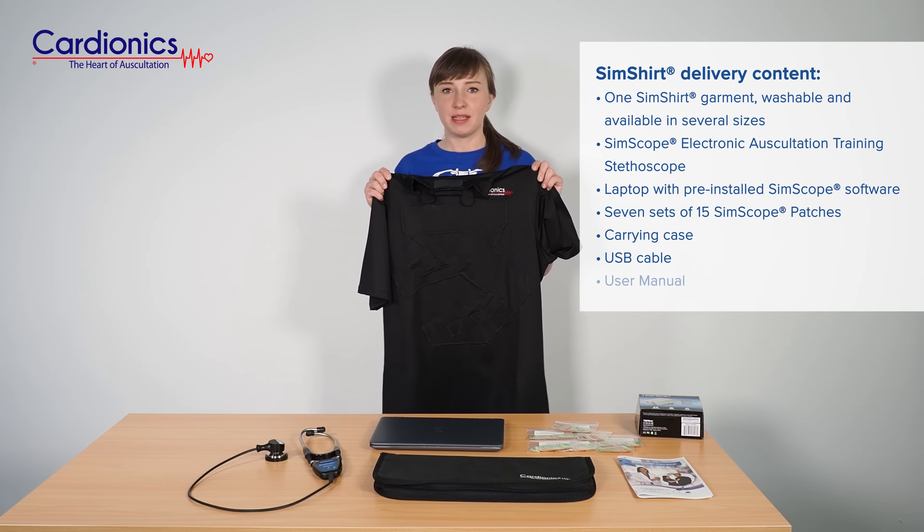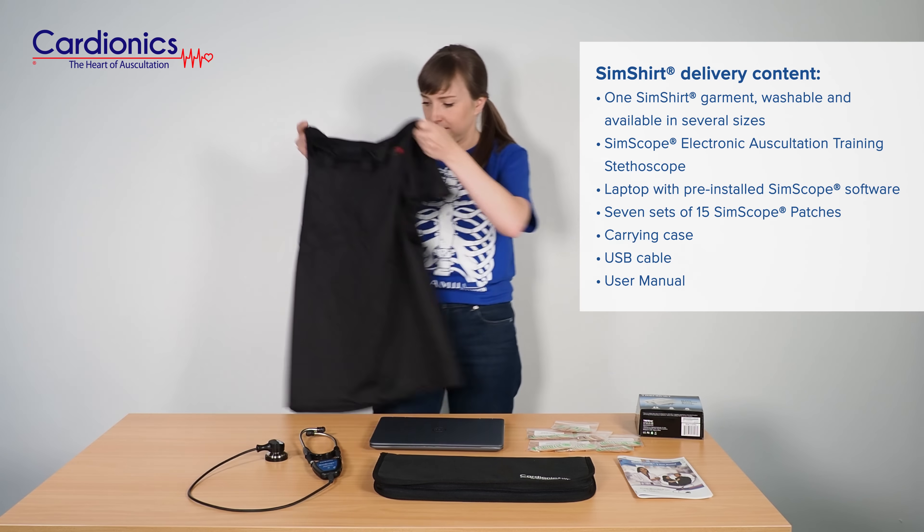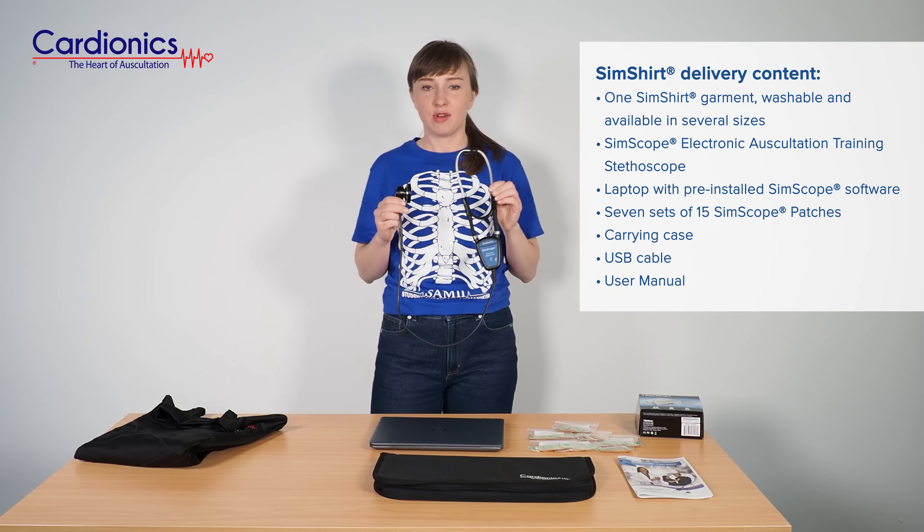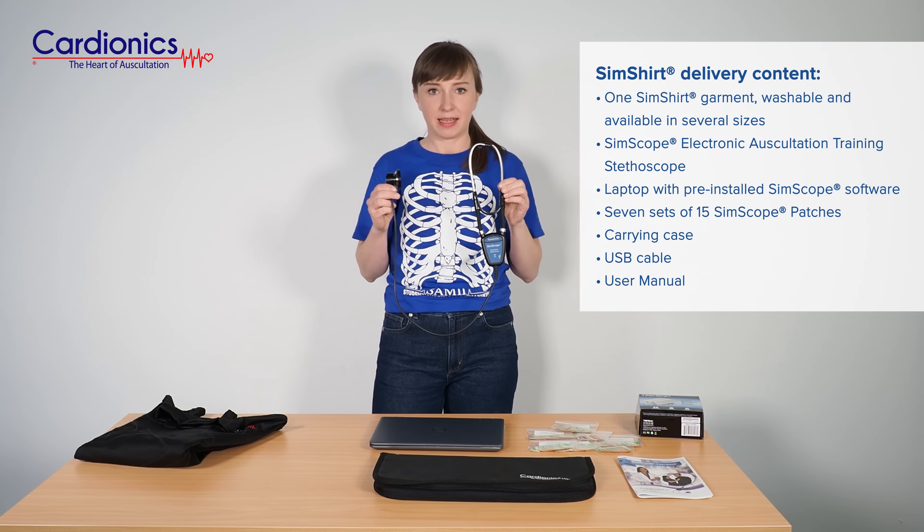The Sim Shirt garment, which is washable and allows you to auscultate at anatomically correct sites. The Simscope stethoscope, which comes with the black carry case.